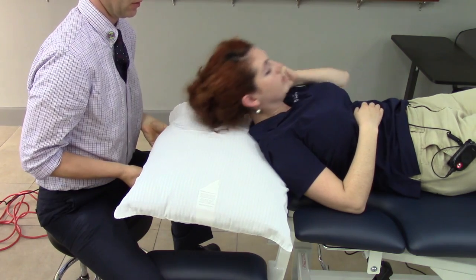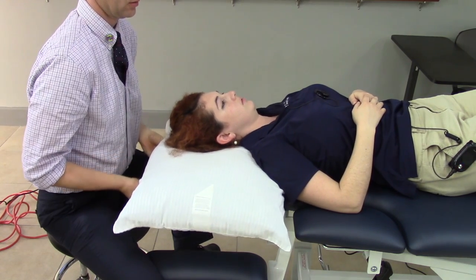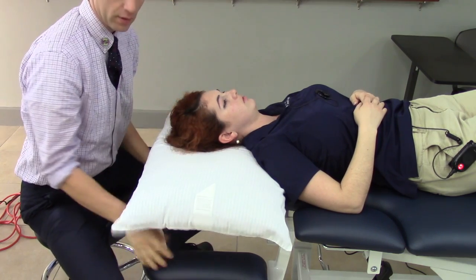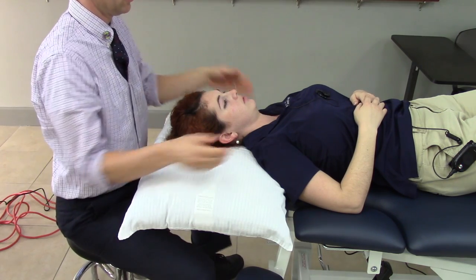You can adjust the top headpiece with the right lever — down and up. You can also rotate the armrest to the outside, allowing for good leg mobility.